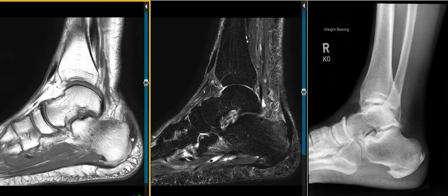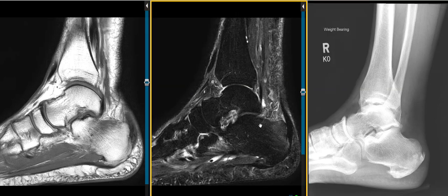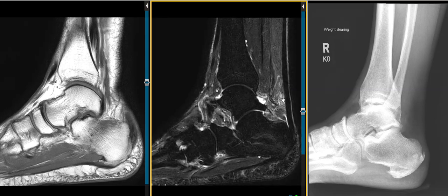We also have a spur. You can see a little bony spur right here, a retrocalcaneal spur in this x-ray. Also we have, again, this bursitis, acute retrocalcaneal bursitis, a little fluid pocket here in a potential space right where the Achilles tendon attaches. And lastly, we have one more thing back here.